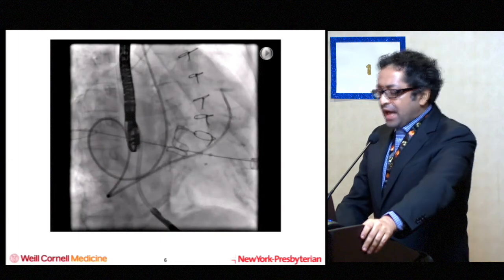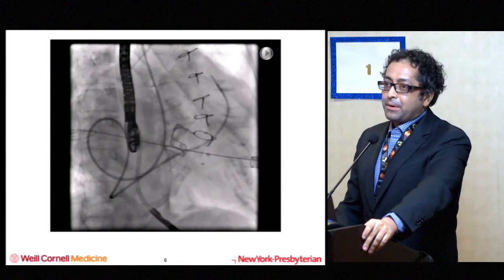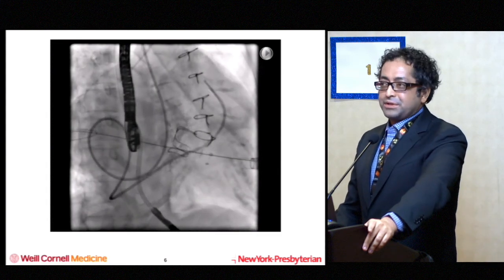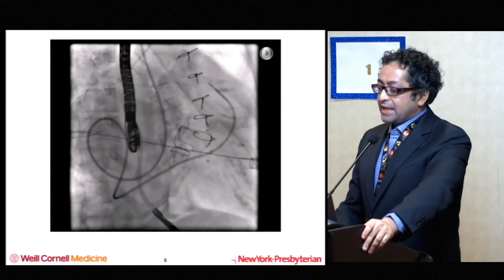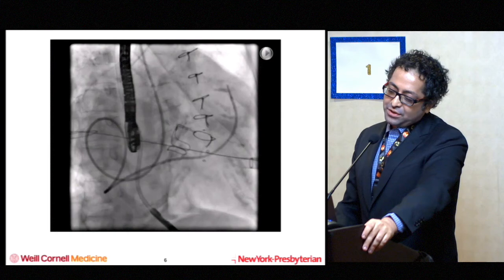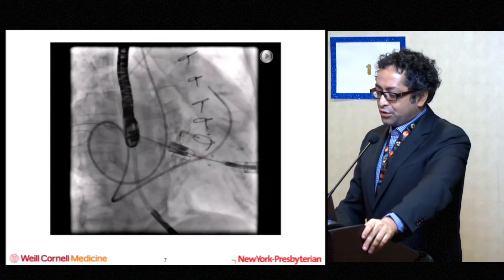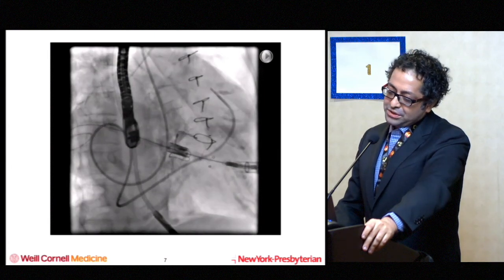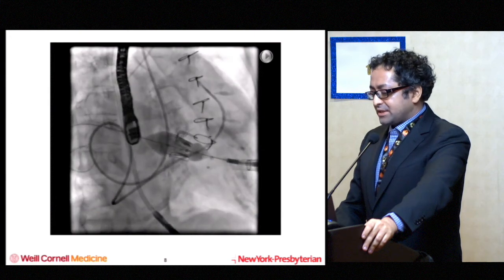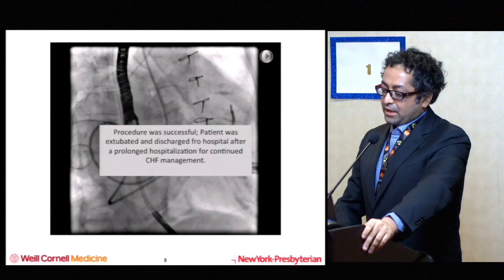At that time, and for most programs, almost all the transcatheter valve-in-valves were being done transapical. Now that has shifted in the last couple of years, but with the transapical approach there was a lot of comfort, with TAVR as well. So just changing the angle, inserting the valve in the opposite direction, and then putting it into the ring. So this is a case where once you get the apical axis, you get the valve in position, you rapid pace, and just like with any procedure, you blow up the valve and hopefully everything works.